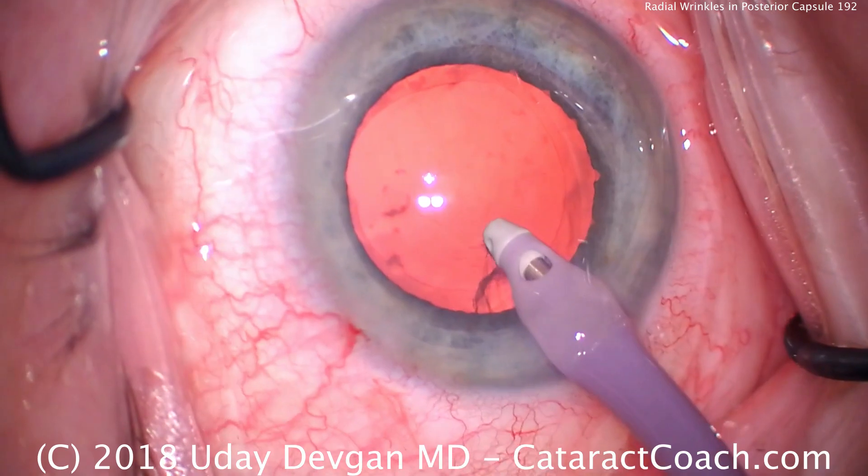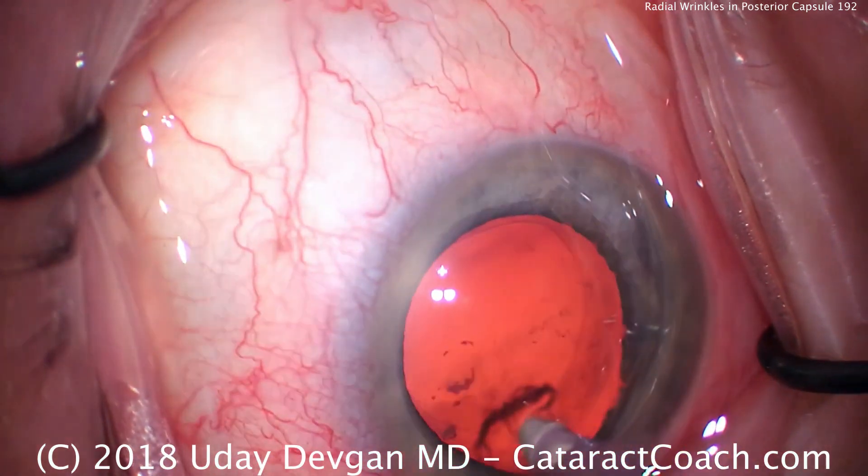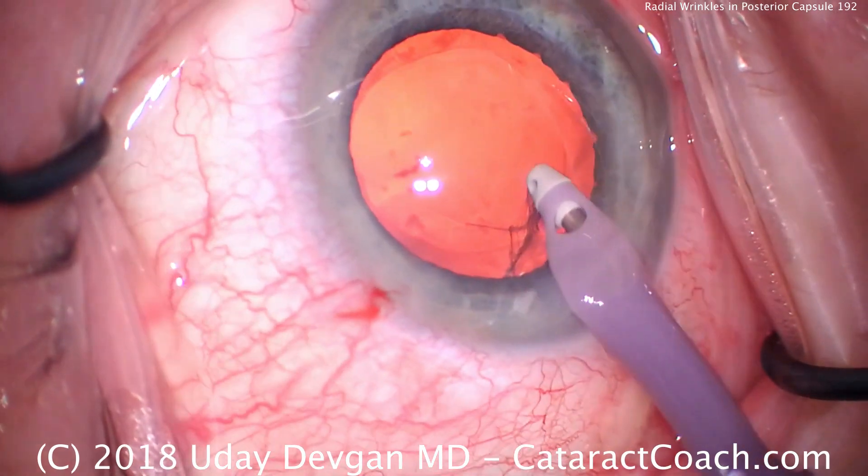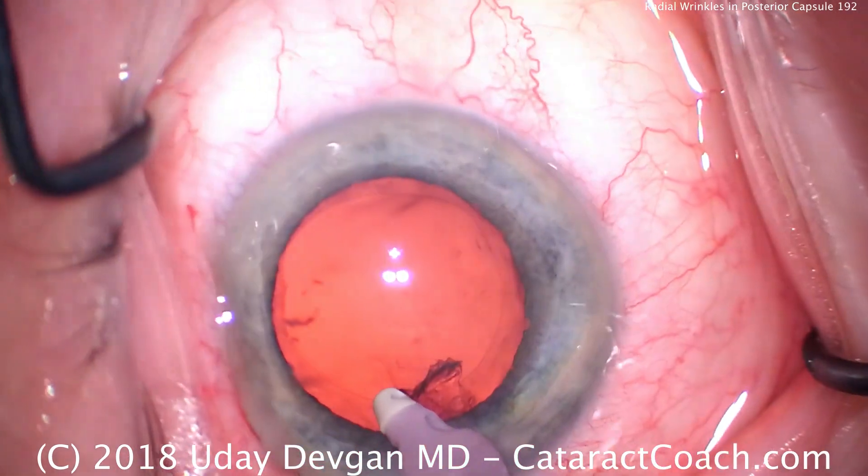Right here — look at that. That's the capsule. So I let go, and then pivot more to grab just the cortex without grabbing the capsule.